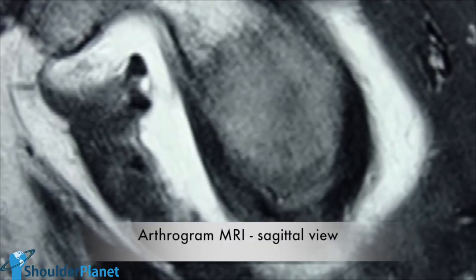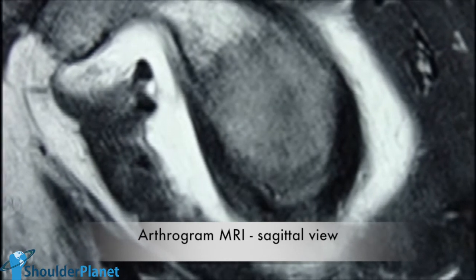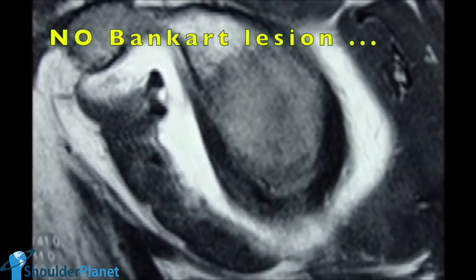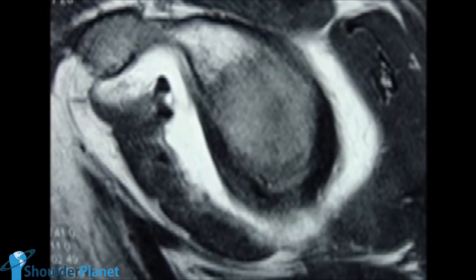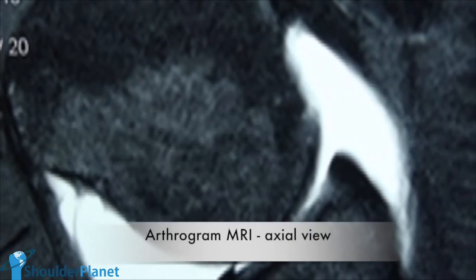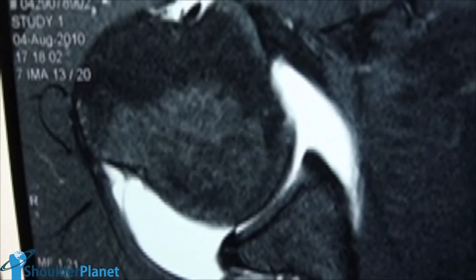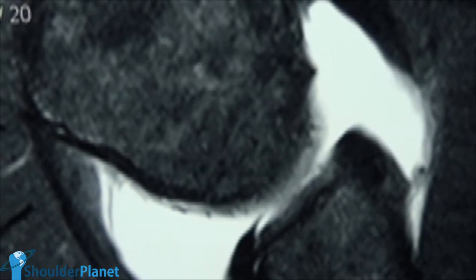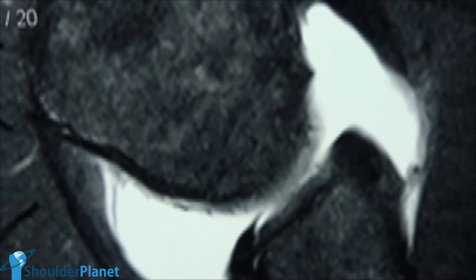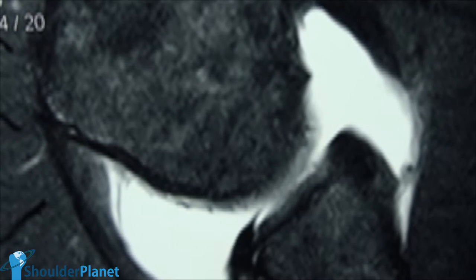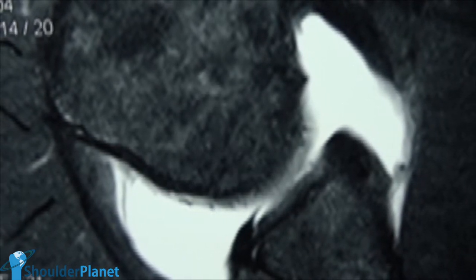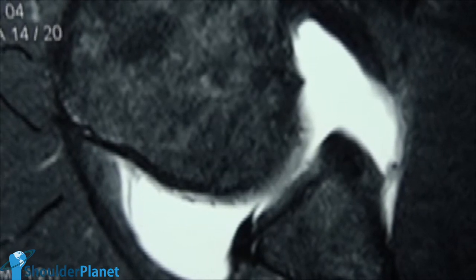This is another image, a T2 sagittal view in which we can see no signs of any standard Bankart lesion. And in this image, an axial T2 cut, we can see that his anterior labrum seems to be quite normal. And finally, this is another axial T2 cut again revealing a quite normal anterior labrum. The patient was told that we would try to fix his HAGL lesion arthroscopically, and if we found that it was not possible, we would very quickly stop the arthroscopy and perform an open Bristow-Latarjet surgery.